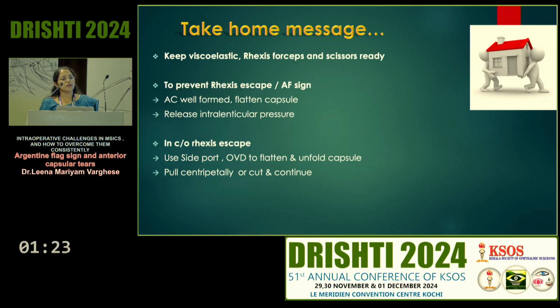Flatten the capsule, unfold it, and pull centripetally. And if it does not come, cut and continue your rhexis.